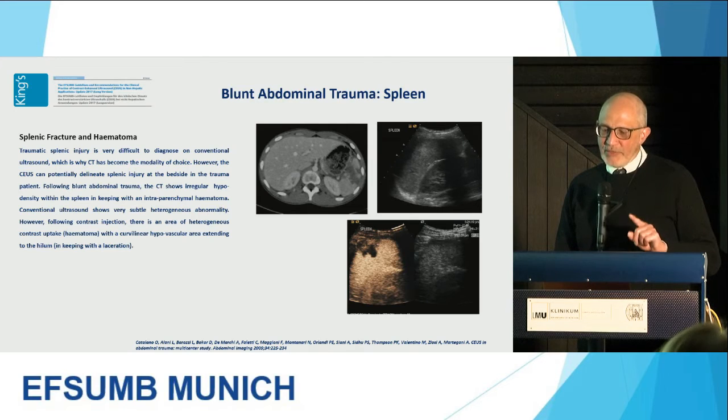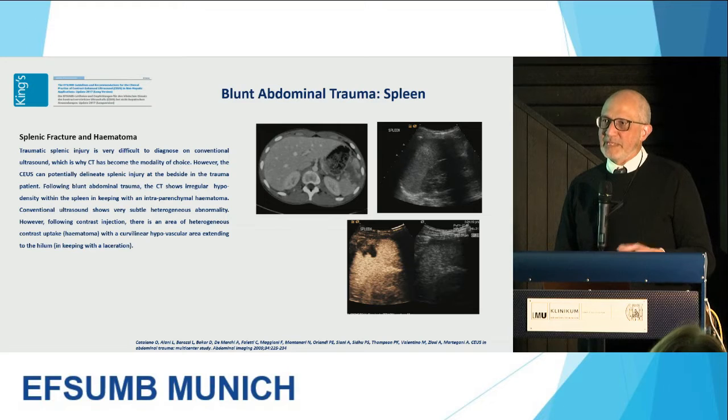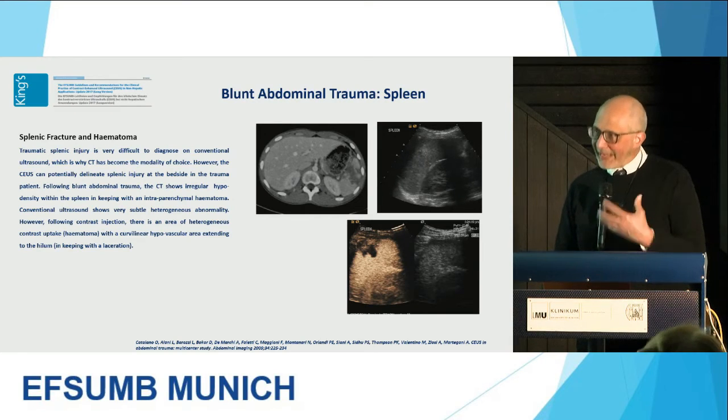So what you can do here is, and our practice is day 5 and day 7 to look at these patients before discharge, because that's the time it takes, and the complication is a pseudoaneurysm that you're looking for. You use the contrast to pick up any pseudoaneurysms before they send the patients home, because most of these patients with blunt abdominal trauma recover.